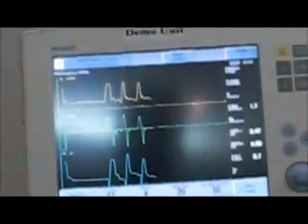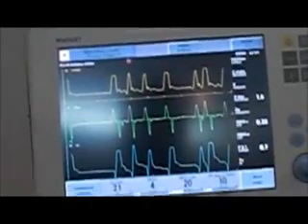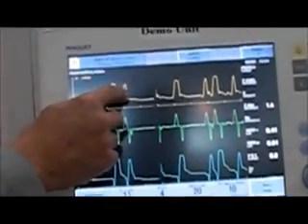So they look different. Here I can choose pressure control above the PEEP for the vent breath — the SIMV breath. Here I can choose the PIP above the PEEP for the baby's own breath. The idea is if the baby is taking a breath by himself, he'll take a small breath because he's young, weak, stressed, and has poor compliance. So I want the vent to support whatever the baby is taking more than my set rate. SIPPV: if I put the pressure support as 10, then I'm very close. The inspiratory cycle off is when I want to terminate the breath — here at 30% of the air going in. So my triggered breath will be a little bit wider than before because I'm letting more air go in, but it still looks different because it is flow terminated.